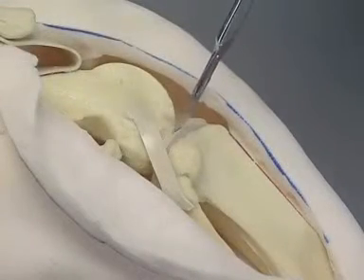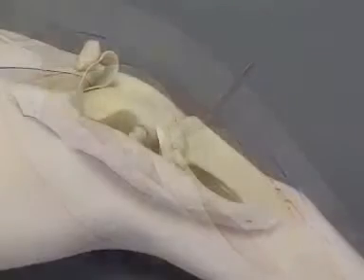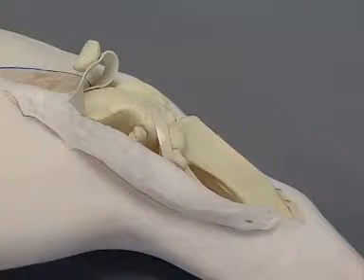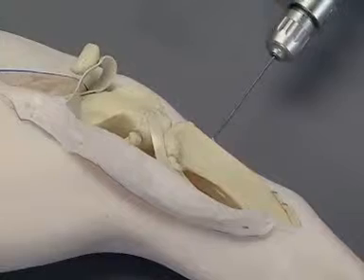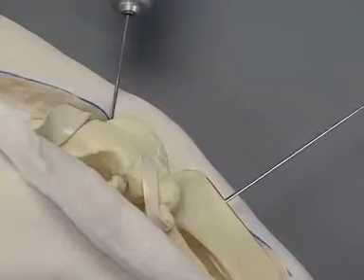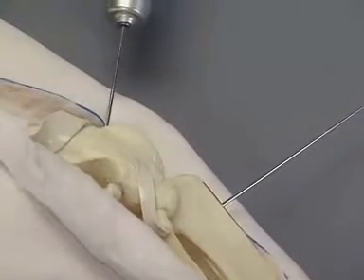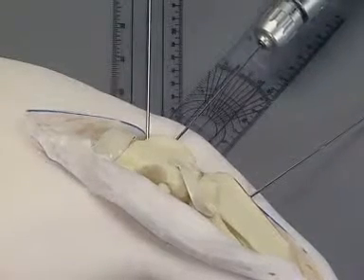The menisci may be excised. To determine the ostectomy angle, three K-wires are placed. The first K-wire is positioned perpendicular to the tibial diaphysis. The second K-wire is placed perpendicular to the femoral diaphysis. The third wire is inserted into the femur, distal to the second wire.